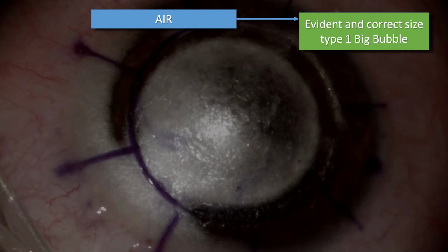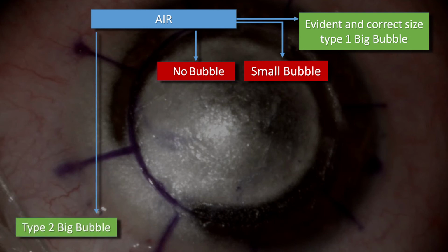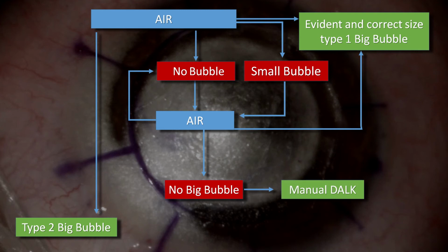If you don't obtain an evident type 1 big bubble, there are three main options that can happen: no bubble, small bubble, or type 2 bubble. When you don't achieve a bubble, you will have to inject more air until you succeed. If the bubble is small, again, you will need to add more air to expand it. If you still don't obtain a bubble, you will have to continue with a manual technique, layer by layer. And finally, if you get a type 2 bubble, you will need to perform a manual technique as well.